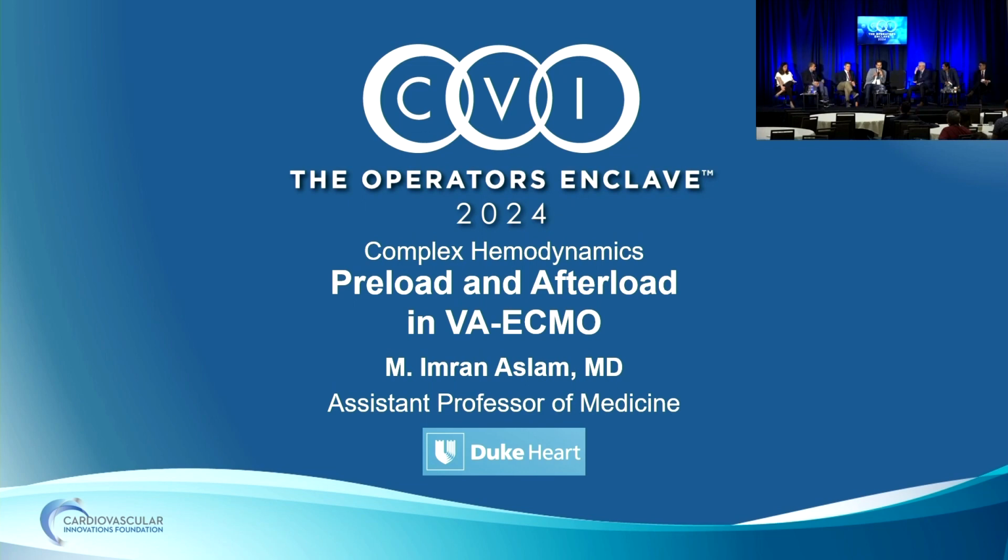We use a lot of inter-atrial septum shunt creation in VA-ECMO to unload the LV, which I think we would have used in this case. We use it a lot in patients who have cardiac standstill or very low left ventricular function after arrest, for example, in VA-ECMO. And we see that not only do the LV filling pressures come down, but the CVP comes way down. It doesn't go up, it goes way down.